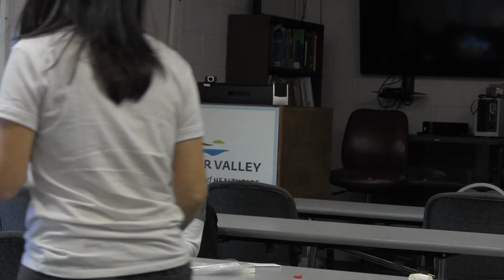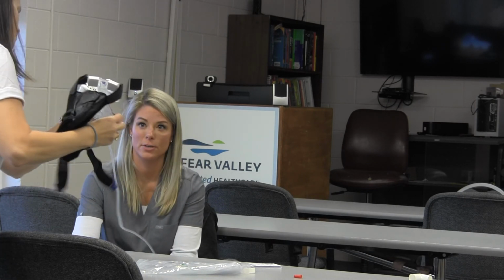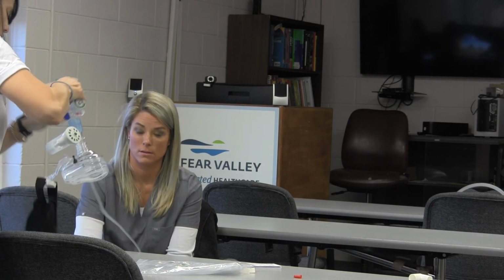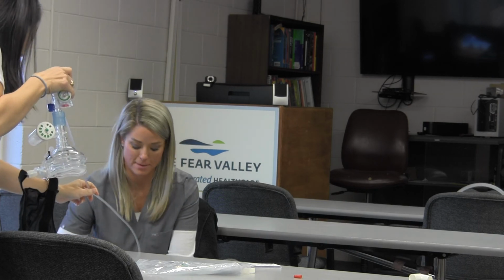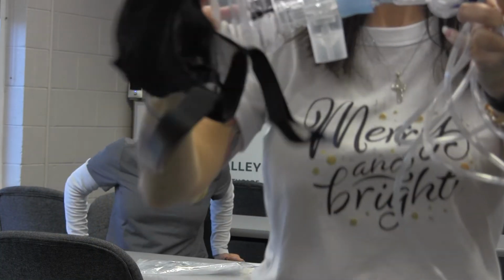Is there any magic number we're shooting to aim for on this one? Yes. If you're using it for your COPD, it's already 3 to 5. And then if it's for your CHF, 7, and then drowning and near drowning is 10. So we're gonna go with the same thing as of right now, unless Dr. Wells decides to change that.